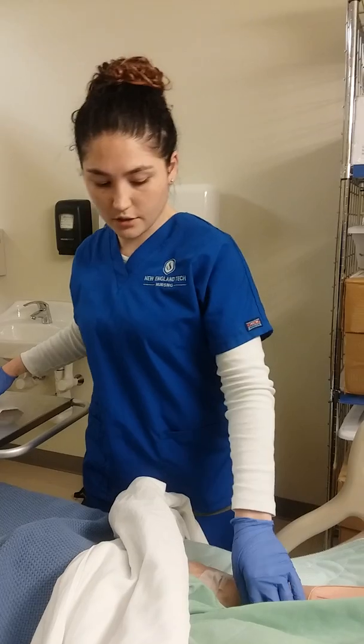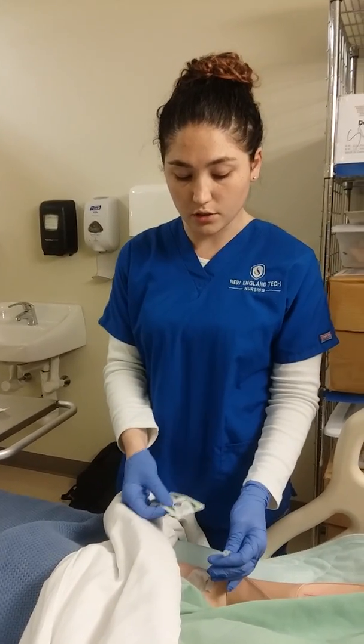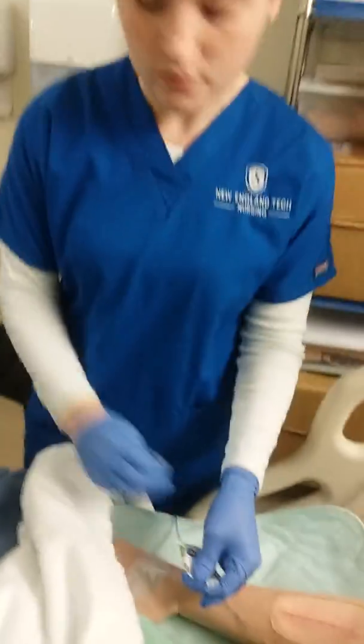So I uncapped my syringe, and I'm going to select the port closest to the site, and I'm going to start by cleaning that with an alcohol swab.